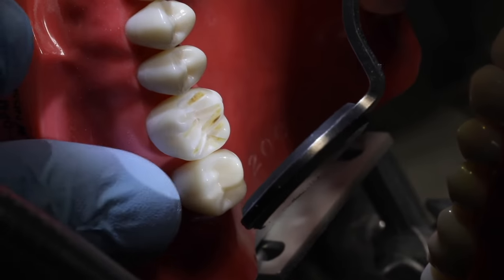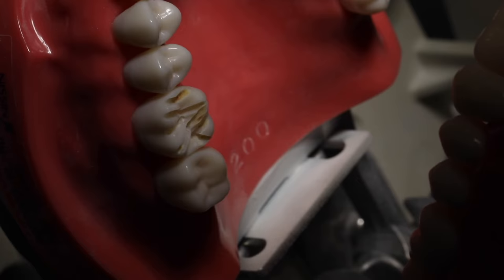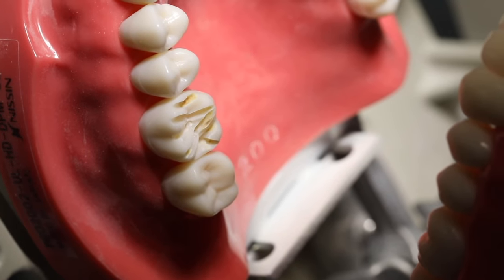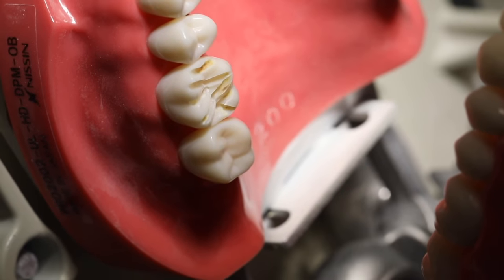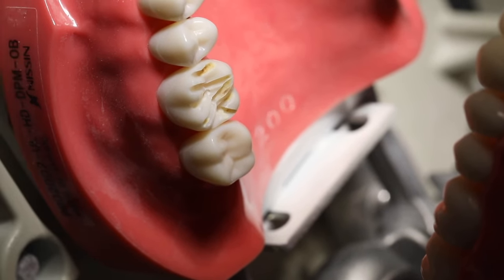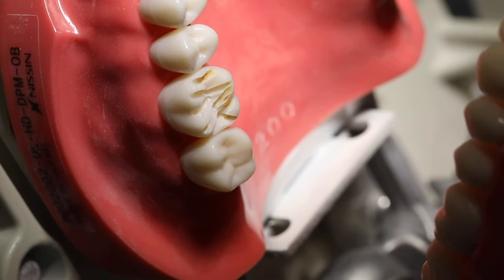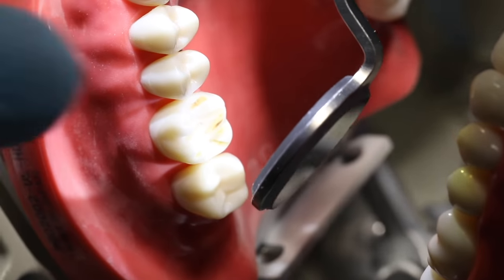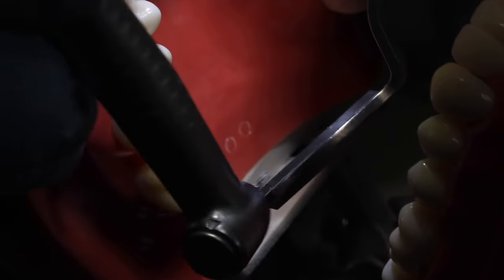We can go ahead at this point and place guide cuts for the functional cusp bevel, but we don't have the advantage of that functional cusp bevel opening up visibility to the lingual aspect of the tooth preparation like we do if it were a mandibular molar. So we'll go ahead and place the guide cuts, but again, we don't get the benefit like we do when it's in the lower arch.